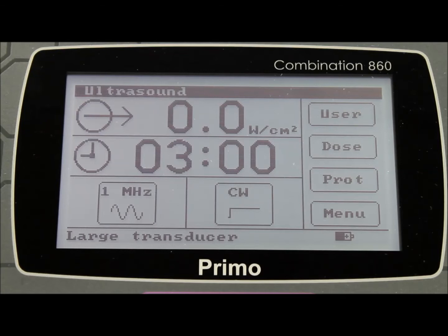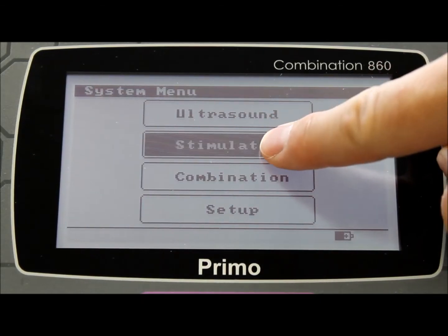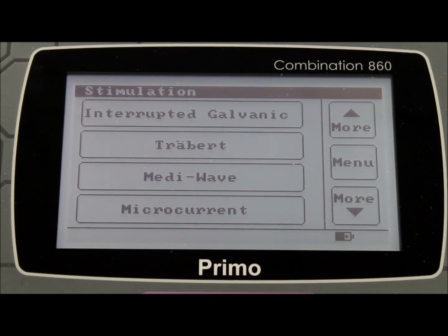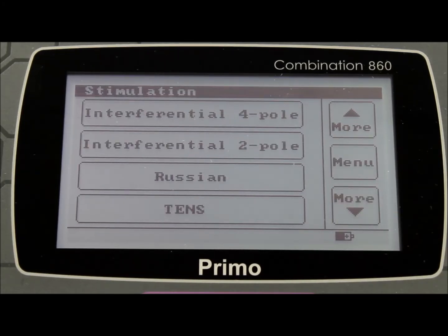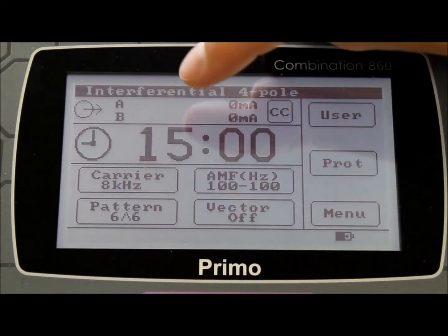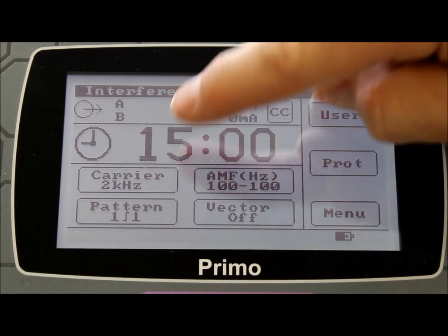Once the ultrasound therapy is finished, touch the menu button to return to the main menu. Within the stimulation option, there are 12 different electrical stimulation modes from which to choose, such as 2 and 4 pole interferential, Russian, TENS, Diodynamic, Sinusoidal, Ferradic and Galvanic, Interrupted Galvanic, Traber, MediWave and Microcurrent. Touch the menu button of your choice of stimulation mode and you will have a selection of parameters. The options available on each button will change each time you hit it, repeating in a regular pattern going forwards only — so if you miss your option, you will need to scroll through to the required choice once again.